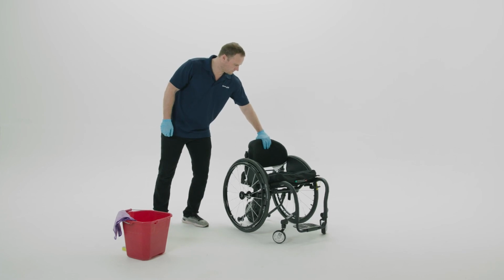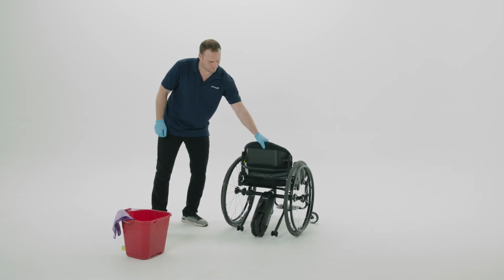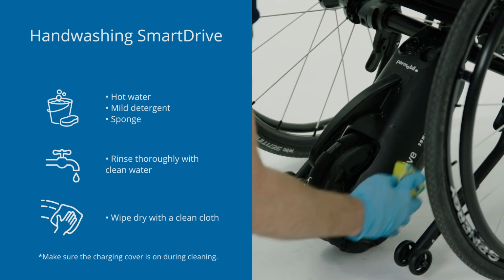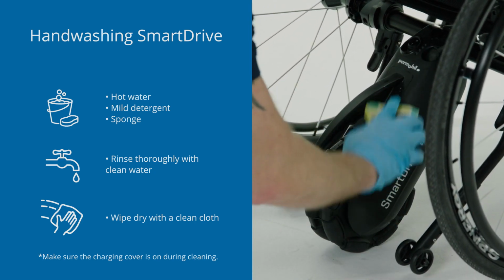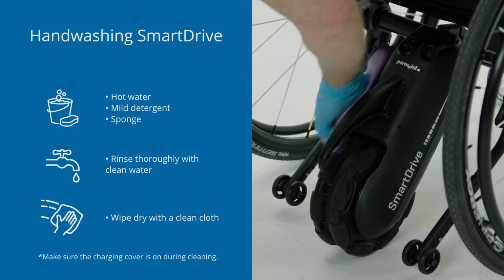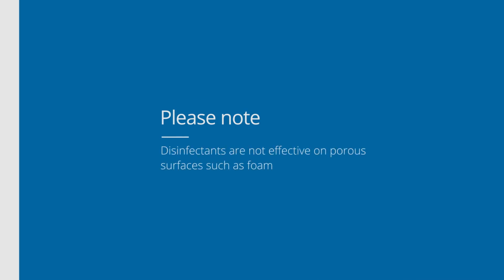While we are here, let's take a look at how to clean your SmartDrive. For the SmartDrive surfaces, you should use a soft cloth or sponge dampened with hot water and mild detergent. Make sure to wipe down surfaces carefully, rinse or wipe with clean water and a soft cloth, and get completely dry before next use. Take special care not to get water or other liquids in the various electronic components of your SmartDrive. Please note that disinfectants are not effective on porous surfaces such as foam.